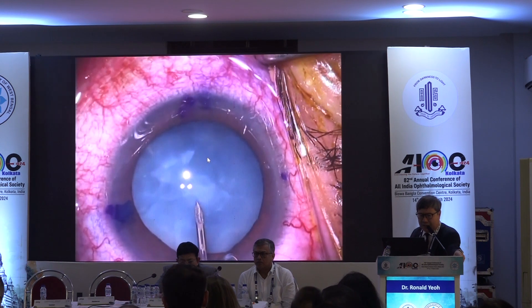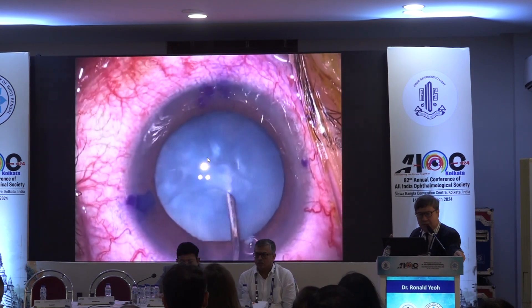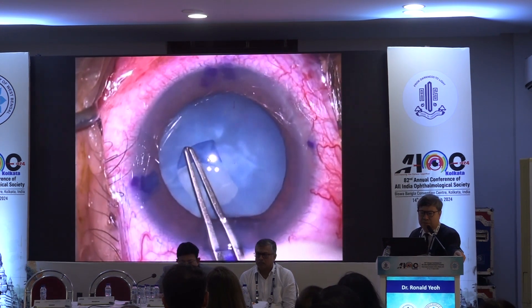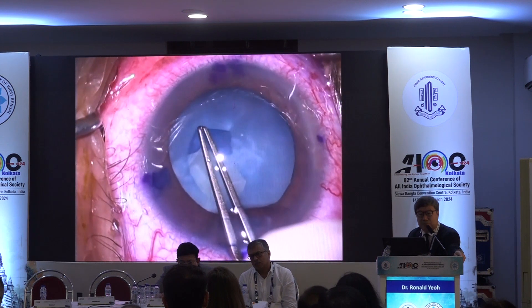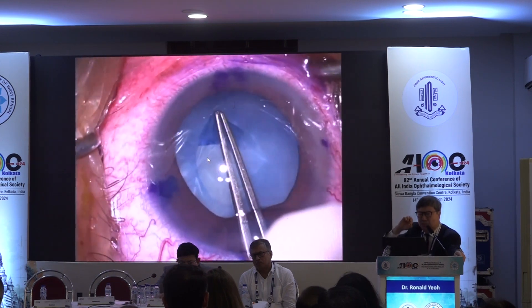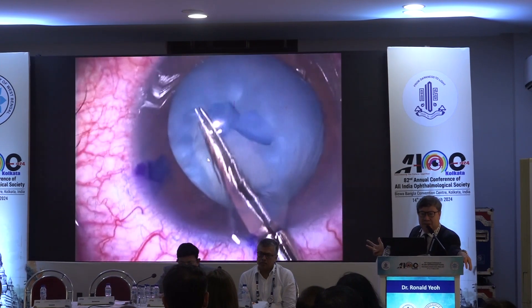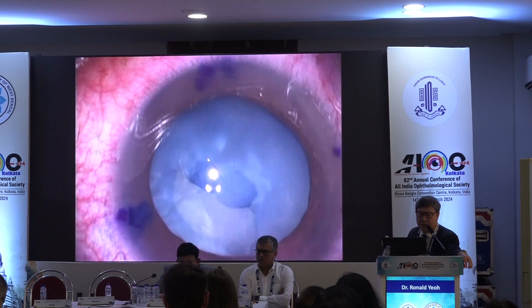Here's another white cataract. What I typically do with these is, in case they're intumescent, I'll go in and just aspirate to decompress the intralenticular pressure, and then I start my capsulorexis. Coming around here, watch for how your anterior capsular flap behaves — if it tears, it means there's significant resistance. And when I come to here, you can see there's resistance. I confess I didn't see the presence of that band. Can you see that band? There's a V-shaped band there. I was so intent on looking at where I was tearing that I didn't see it. So I'm encountering resistance here, and I'm cutting where my flap is, not where that band was.